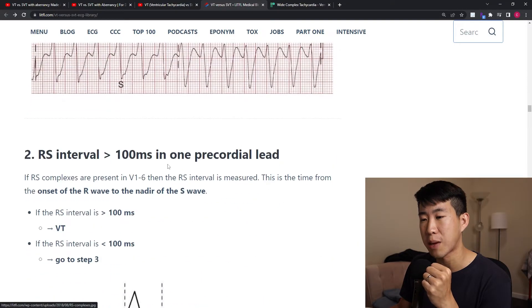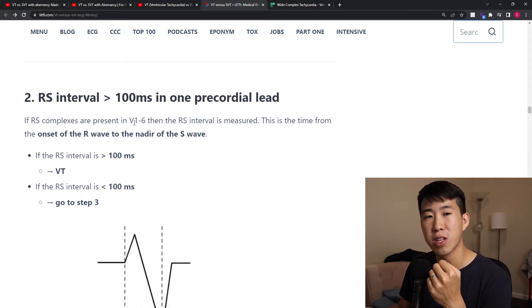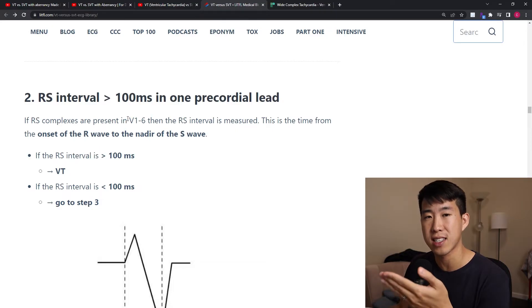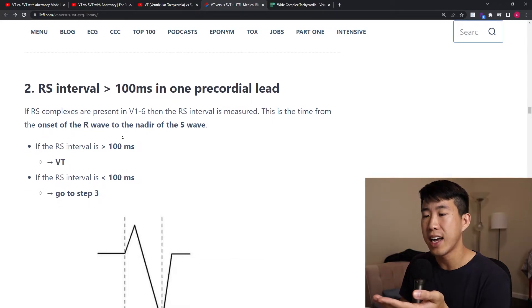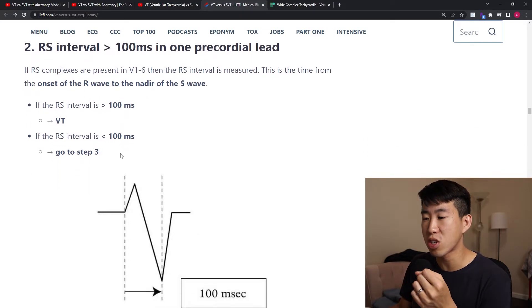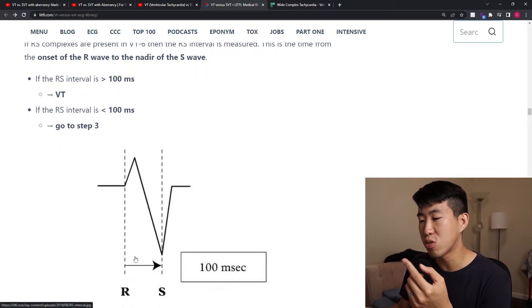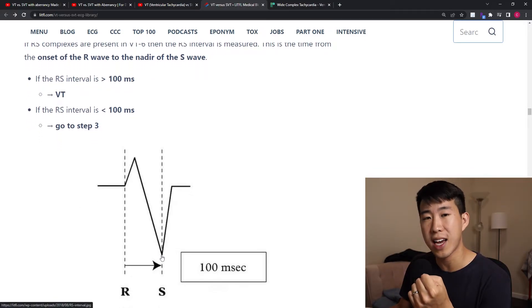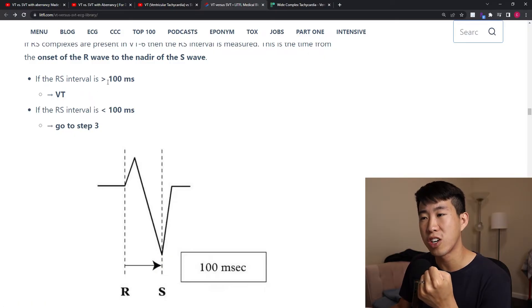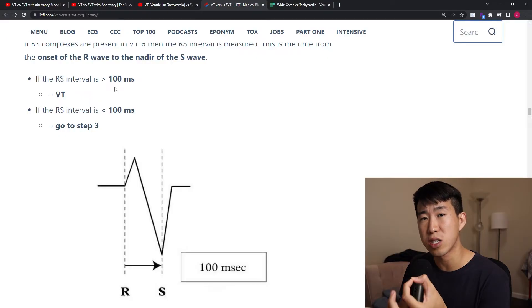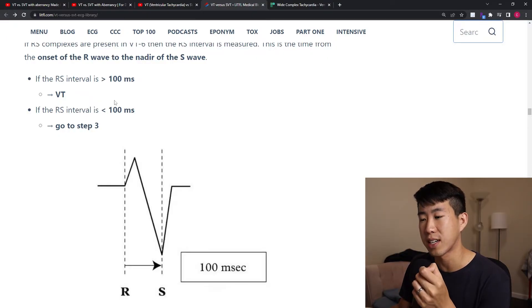Step two is looking at the RS interval — if it's greater than 100 milliseconds, that's Brugada sign and diagnostic for VT. You measure from the beginning of the R complex to the bottom of the S complex. On a regular EKG, greater than 2.5 small boxes equals greater than 100 milliseconds. If it's less than 100 milliseconds, proceed to step three.